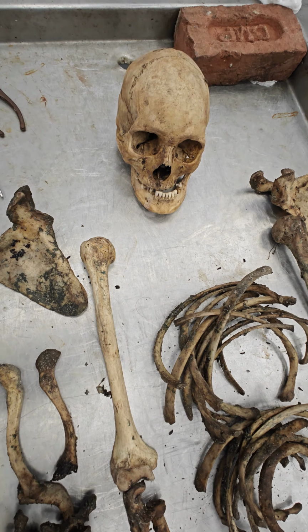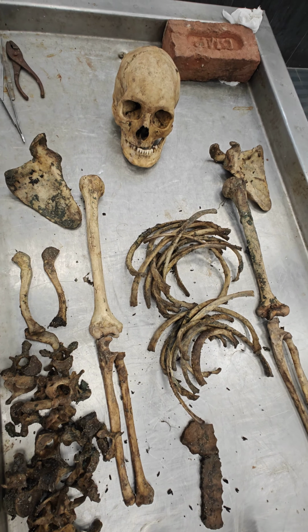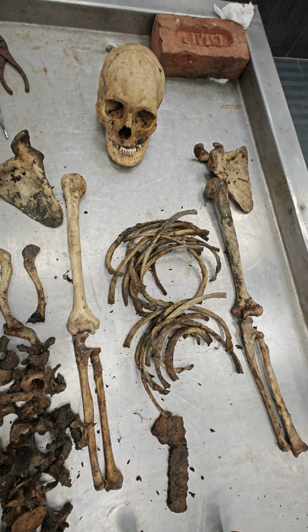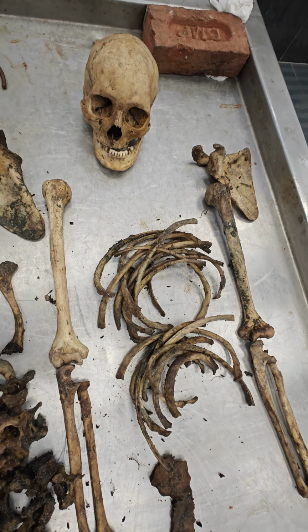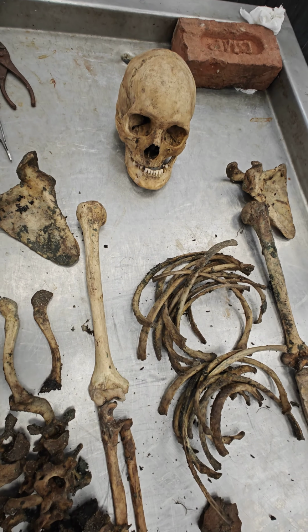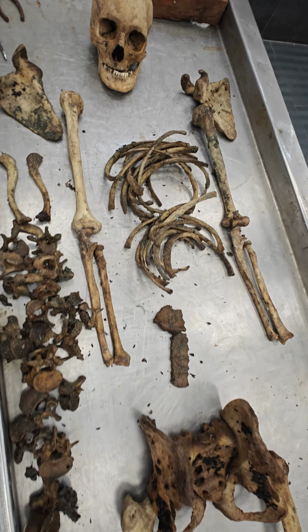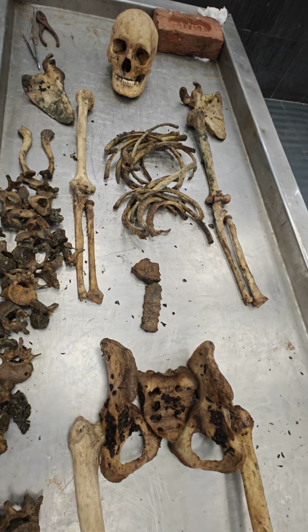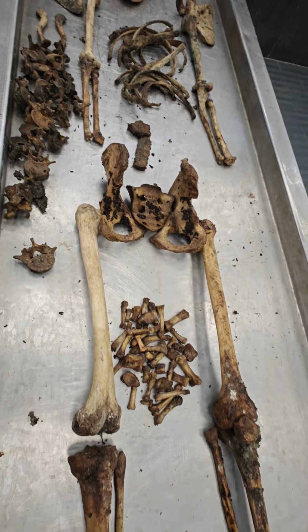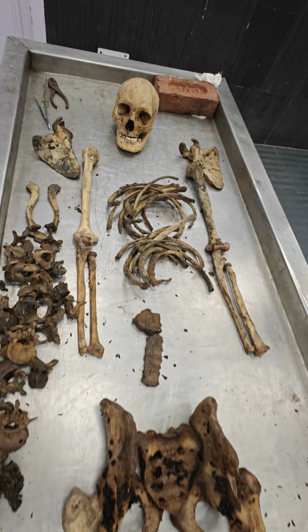So, good afternoon. This is the postmortem examination of skeletonized remains of an unknown body. This dead body was lying at some abandoned place. It was dug out, and the body is completely skeletonized. The skeletal remains are completely disarticulated, and we have placed the bones in anatomical position. This is the way we see from upside downwards.